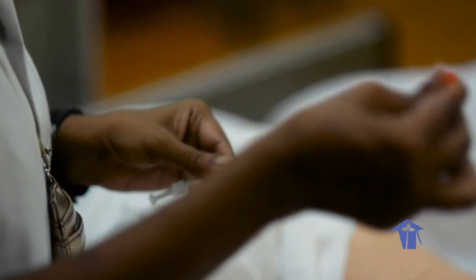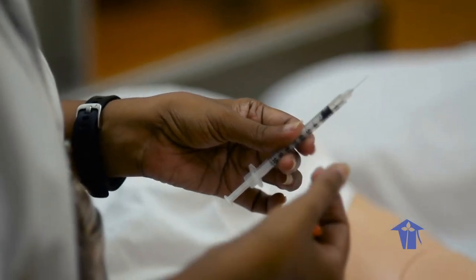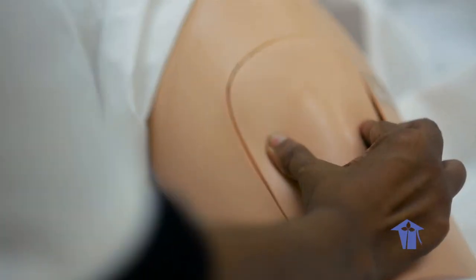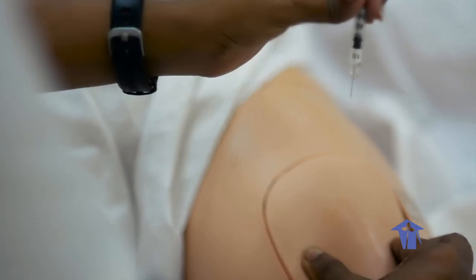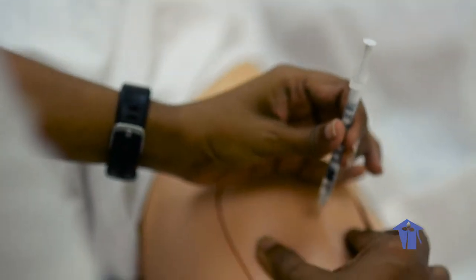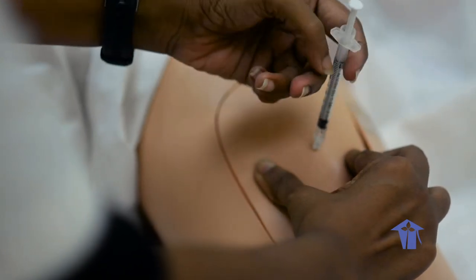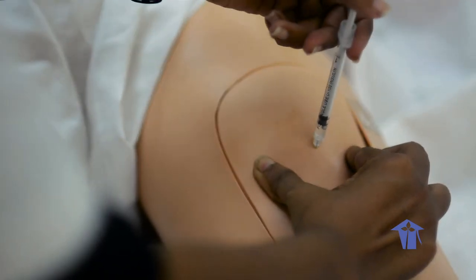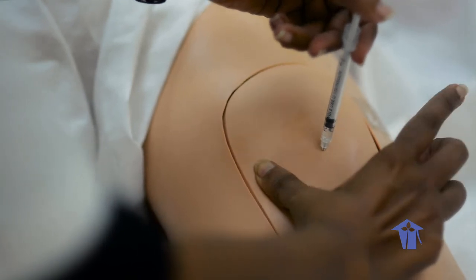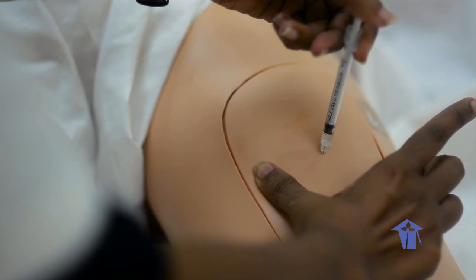Remove the needle cap with non-dominant hand, pulling it straight off. Bunch the tissue around the injection site. Hold the syringe in the dominant hand between the thumb and the forefingers. Inject the needle quickly at a 90 degrees angle. After the needle is in place, release the tissue and administer the medication.